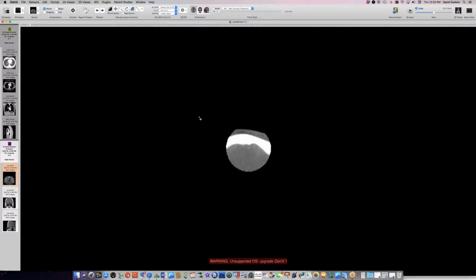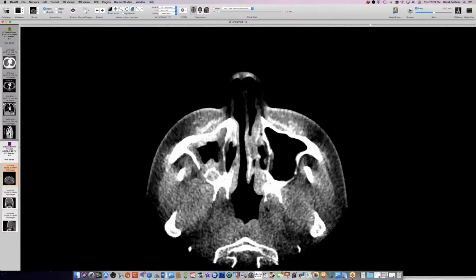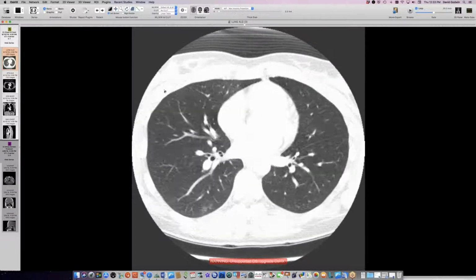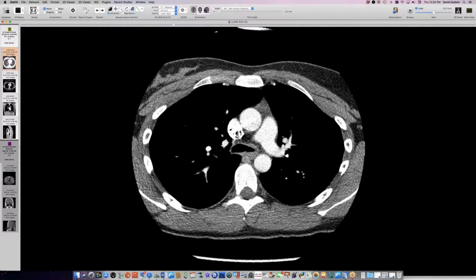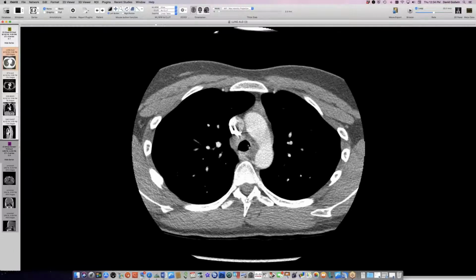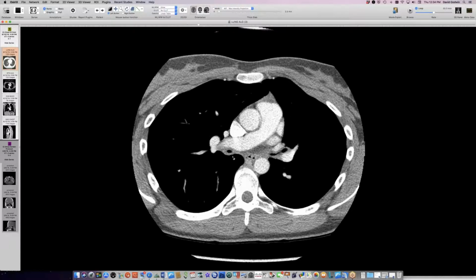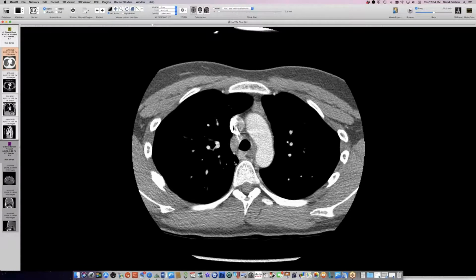Let's see, who else do I have here? This is a woman with GPA and with sinus disease here, pretty extensive sinus disease here, and in terms of her chest abnormalities here, her lungs are pretty good. Maybe a little scarring here in this left base, but the interesting abnormality is the airway here, with airway involvement probably by her GPA, with this thickening around the lower trachea and then the proximal bronchi on both sides, and more narrowing here on the left and the right with this thick wall. Here's the thick wall of the right upper lobe bronchus, and then bronchus intermedius is also thickened. So then things open up past that. So airway involvement here of GPA.